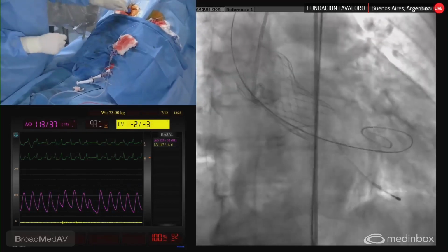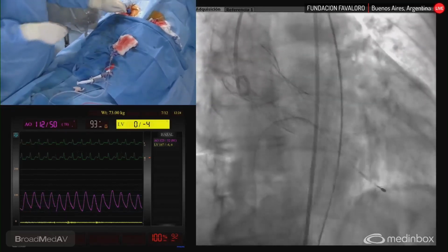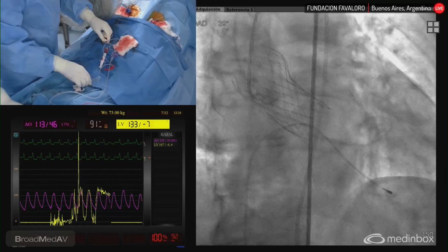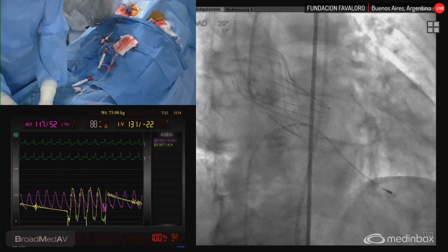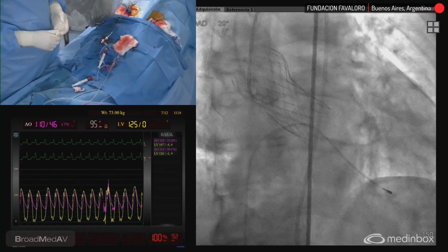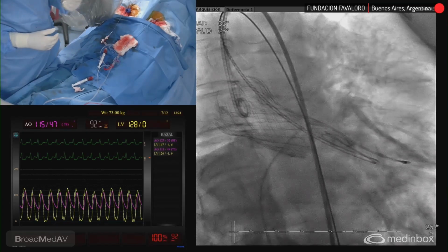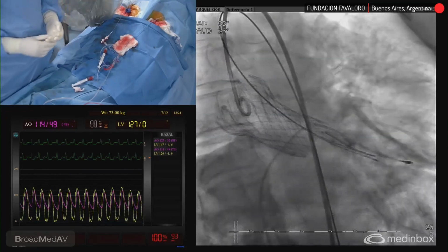And also, it's important to follow the recommendations when you are using cusp overlap view. Don't pay too much attention to the right or the non-coronary cusp when you are going to the left oblique, because here the valve was okay. It was contacting the left cusp. The depth was probably 3 or 4, and actually after the movement, it finished probably 6 millimeters below the left coronary cusp. And additionally, if for any reason, even in our case, we decided to recapture and deliver again, you have to remember to go back to the cusp overlap view, because if you do it on the left view, you are going to our old technique. And remember that our old technique has a higher permanent pacemaker implantation rate.